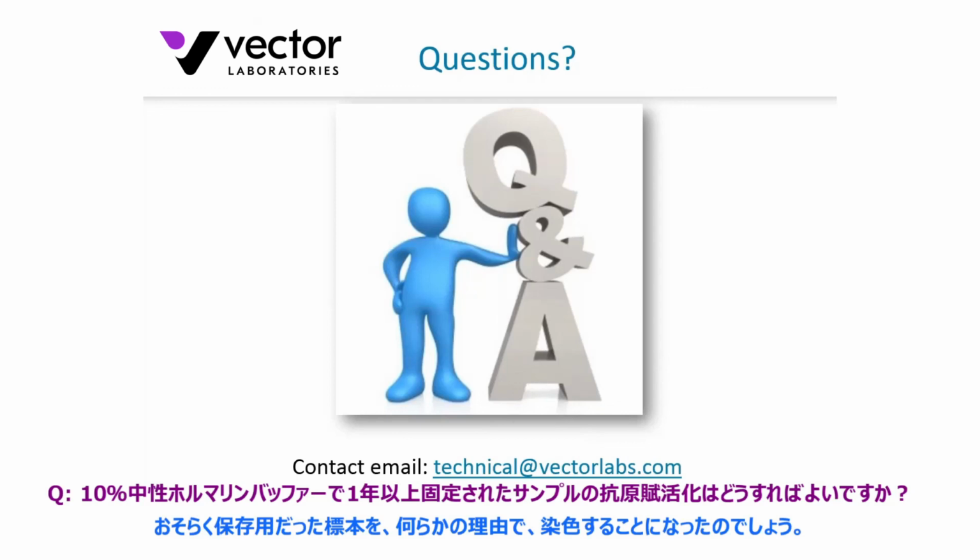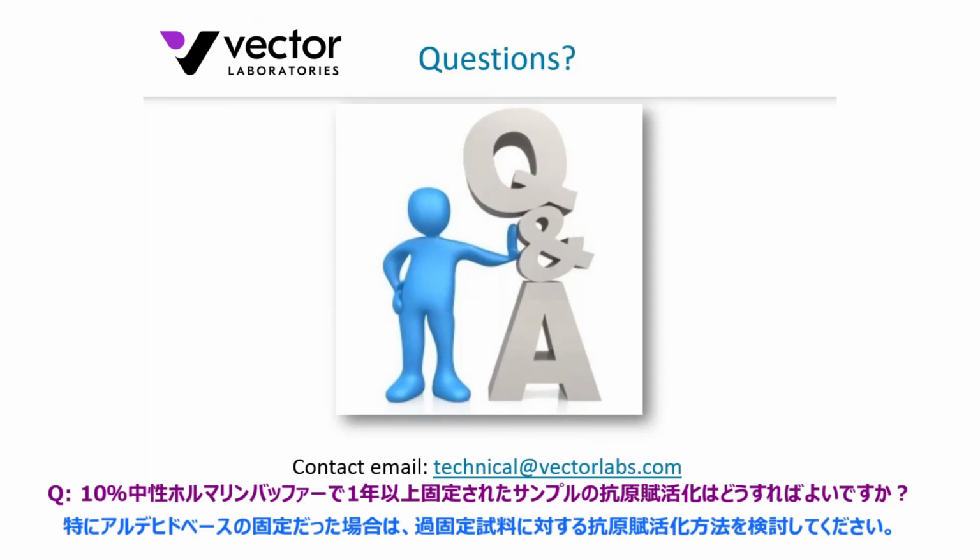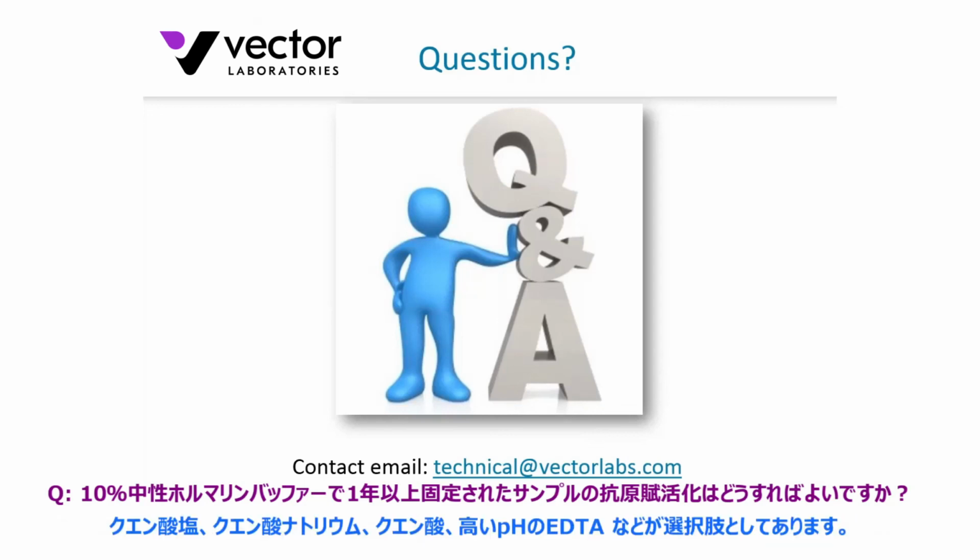So maybe this was an archive specimen, and for whatever reason we're finally getting around to undertaking that. Have a look at the literature out there. I did pop up one reference about en-bloc antigen retrieval in frozen tissue. I would certainly highly recommend looking at antigen retrieval methodologies for overfixed material, particularly if it is an aldehyde-based fixative, which it is. So certainly that would be recommended.